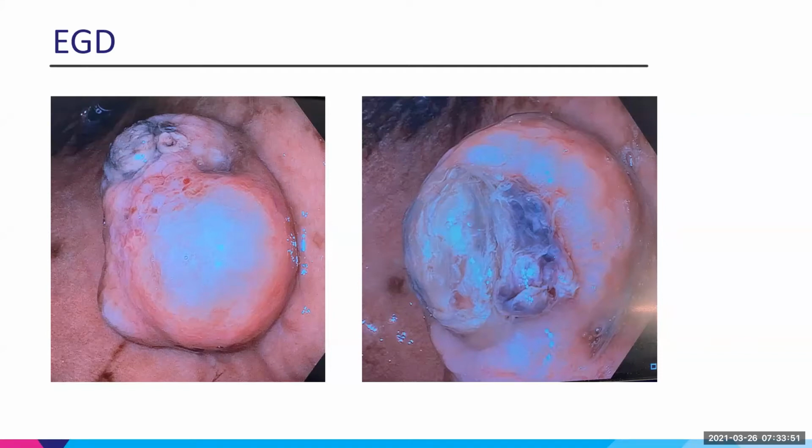And even for the larger GISTs, like the greater than 10 centimeters that you talked about, the surgeons will oftentimes give the patient Gleevec or imatinib to try to shrink it and improve their surgical chances. The only caveat is that some locations are harder in the stomach to do these types of resections. So the fundus in particular, because you've got to work in that U-turn retroflex position, that can sometimes be challenging.